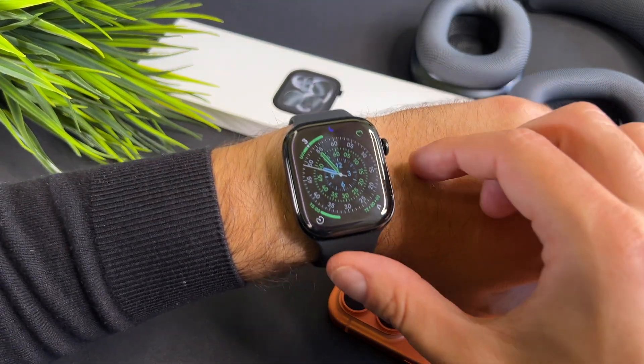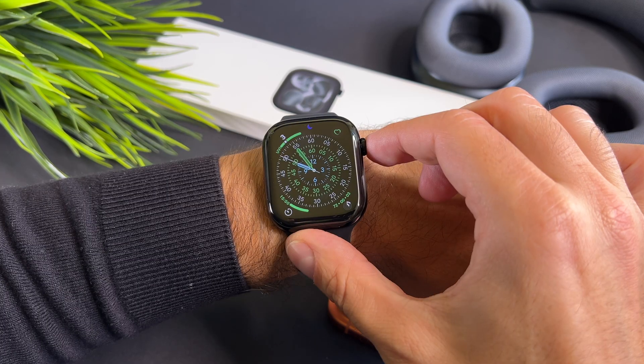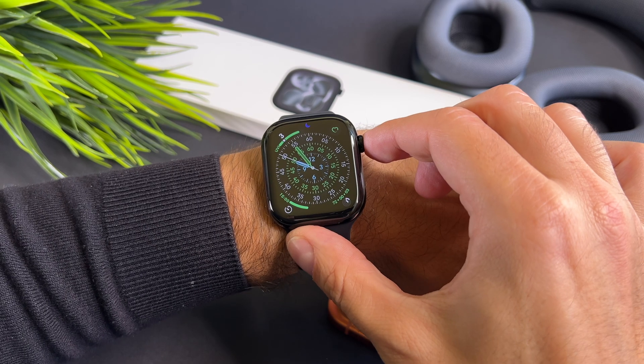Hi everyone! In this short video I will show you how to use the ECG app on your brand new Apple Watch. Since I am not a medical professional, in this video I will focus on the app functionality only.